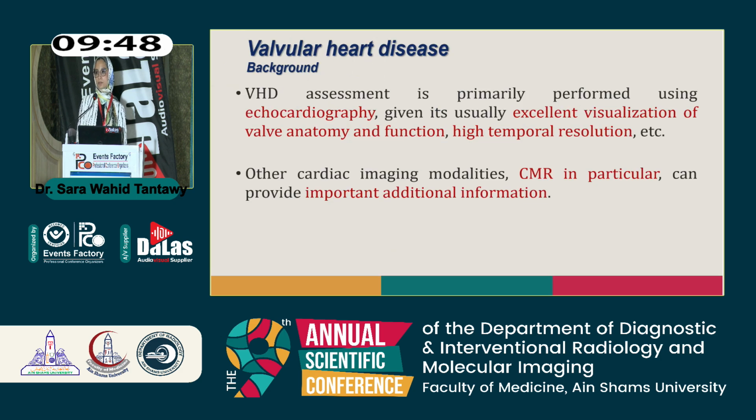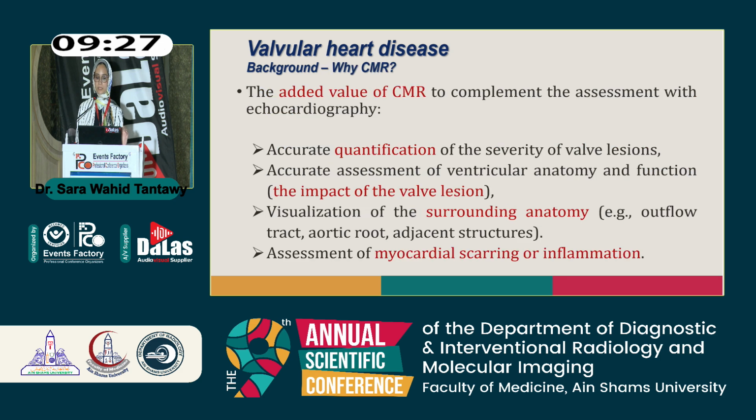Actually, the role of CMR is secondary in valvular heart disease. We usually start off with the echo, and echo is the main modality to diagnose the valvular lesions because it has high spatial resolution, high temporal resolution, so it's excellent in visualization of valvular anatomy and dysfunction. But CMR also has important additional information. Why? Because it can accurately quantify the severity of those lesions.